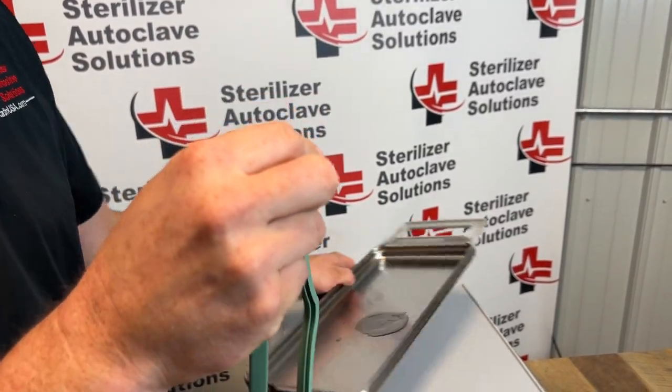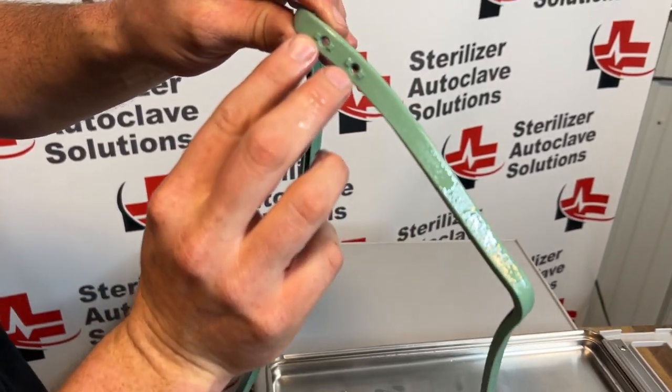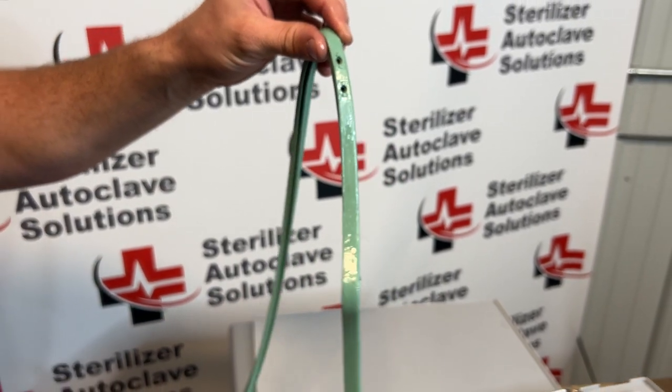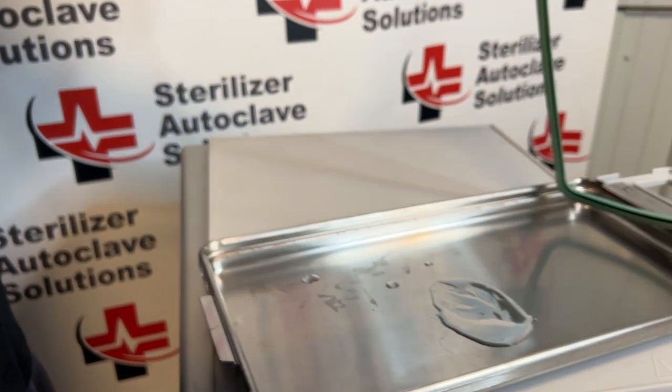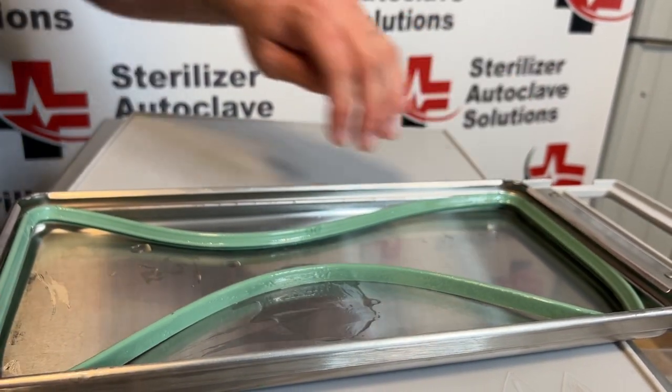Next I'm going to find in the seal where the two holes in the back are, with these square blocks. The nubs go to the back of the cassette, and I'm just going to gently place this entire cassette seal in there like so.